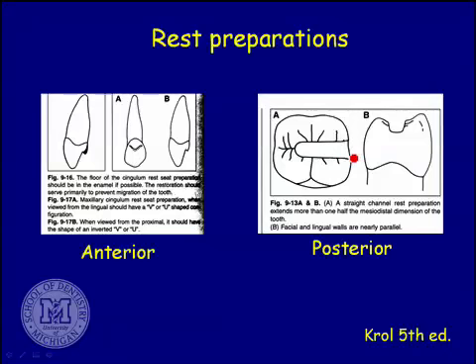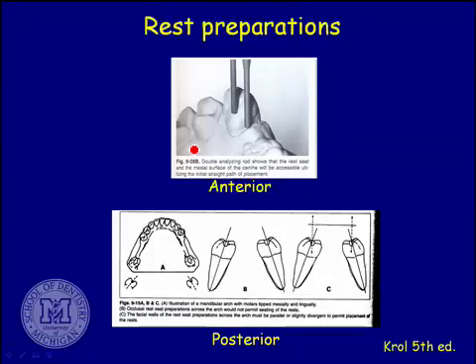And so in those situations for molars, and then in the cuspids, it's a typical little chevron rest, or many times I'll even just use a flat rest that's positively inclined toward the lingual of the tooth. And again, if the teeth are tilted lingually, if you were to imagine taking a survey that would come straight down on the lingual of that tooth, to have your framework clear the lingual surface of the tooth, it has a hard time resting against soft tissue. So that elongated rest will just use the occlusal and the mesial proximal surface, and you don't care that there's no undercut on the buccal, and you don't care that the tooth is tilted lingually a little bit.